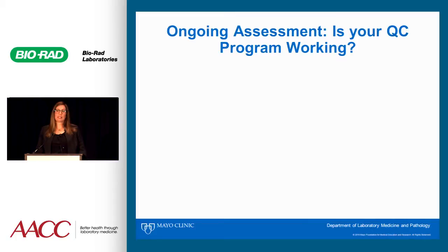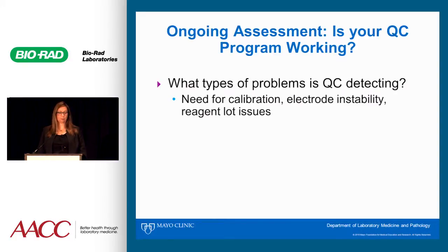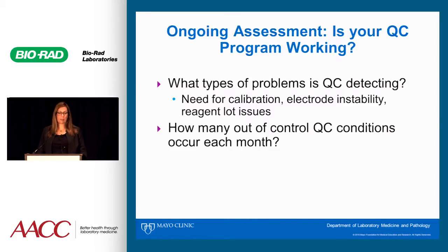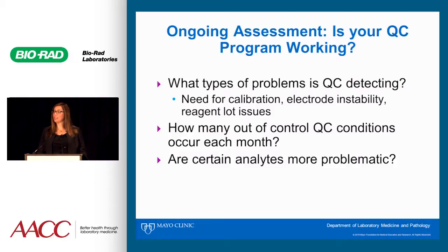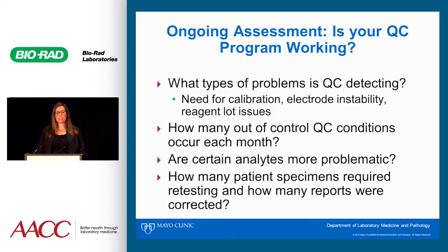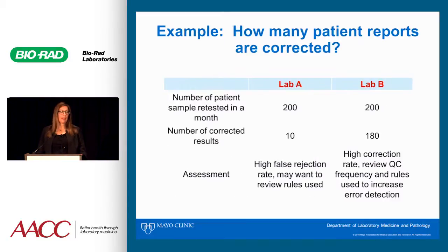The next important phase to consider is ongoing assessment — asking whether your QC program is working. What types of problems is QC detecting? Commonly it's the need for calibration, changing an electrode, or a reagent lot issue. Also ask how many out-of-control QC conditions occur each month, whether certain analytes are more problematic, and how many patient specimens required retesting versus how many reports were corrected. As a generic example: Lab A and Lab B both had to retest 200 patient specimens in a month due to out-of-control conditions.